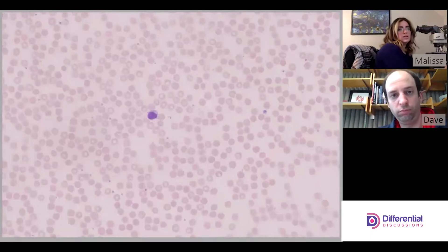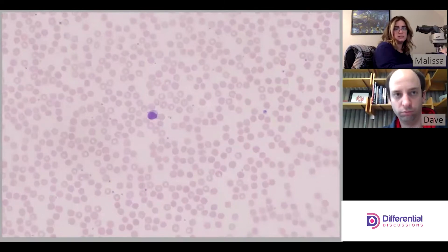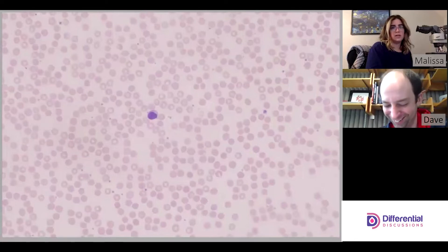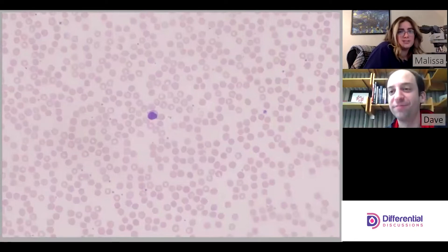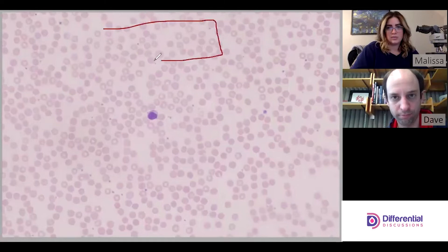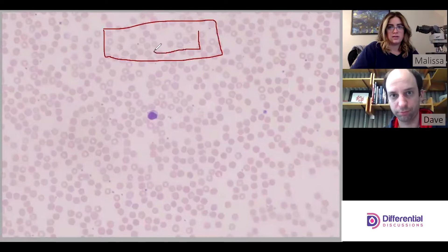All right. And then we count one nucleated cell here. And it should be noted that I'm just moving to the next adjacent field.